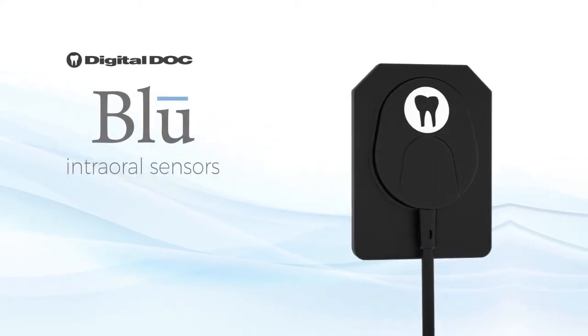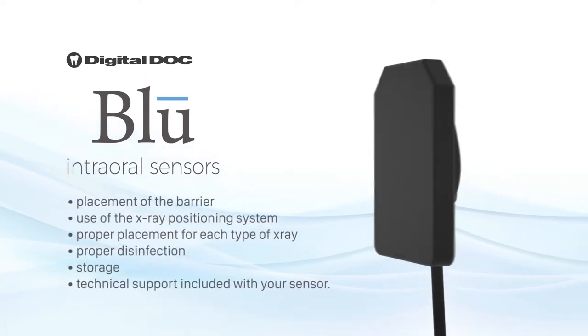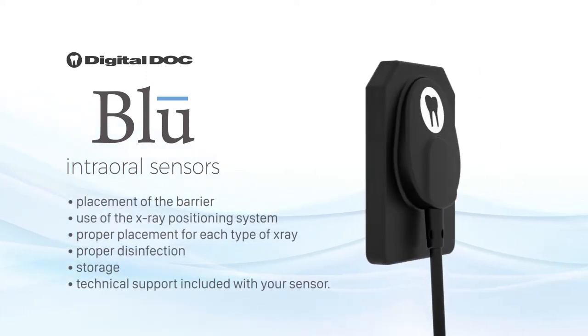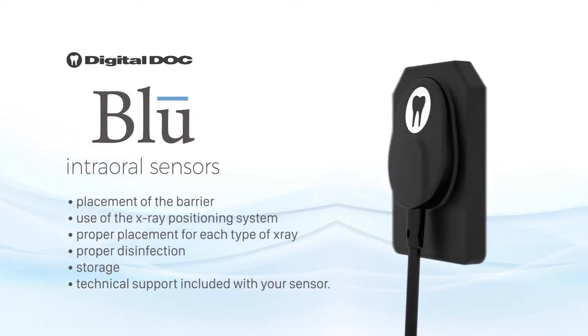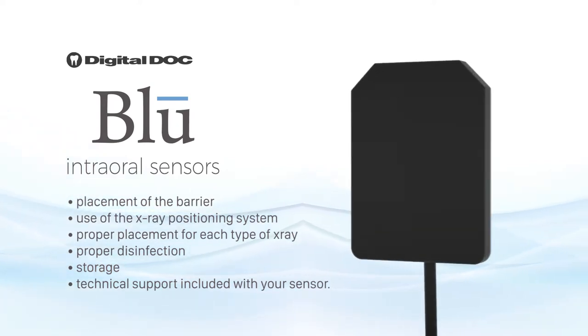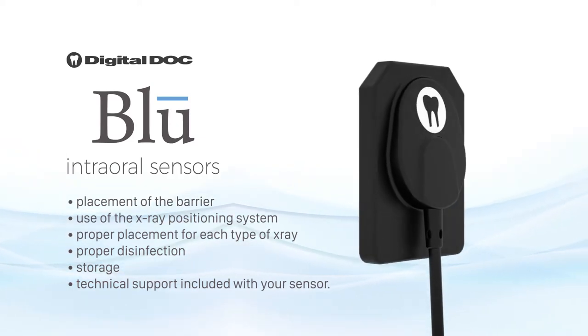Welcome to the training of DigitalDoc's Blue Digital X-Ray Sensor. Today we will cover placement of the barrier, use of the x-ray positioning system, proper placement for each type of x-ray, proper disinfection, storage, and technical support included with your sensor.